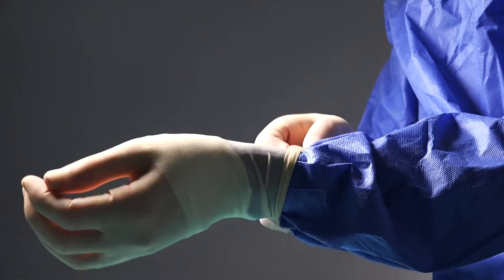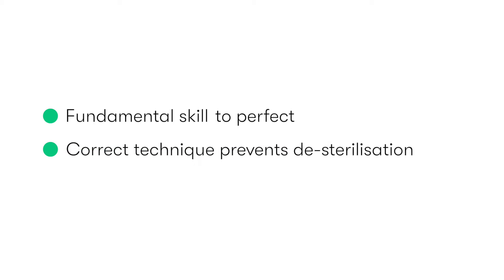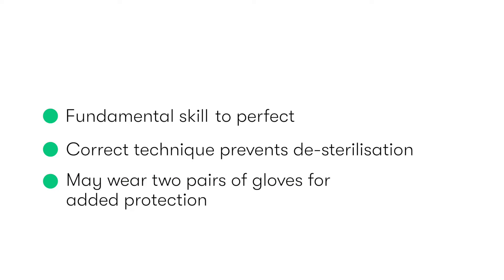Being able to don a sterile surgical gown and gloves in the correct manner is a fundamental skill for all members of the surgical team. It's vital that impeccable technique is used throughout the process to prevent de-sterilisation of the gowns, gloves and the instruments used during the procedure. The use of two pairs of gloves is increasingly common, and it's recommended to help reduce the risk of transmission of blood-borne infections from needle stick injuries.